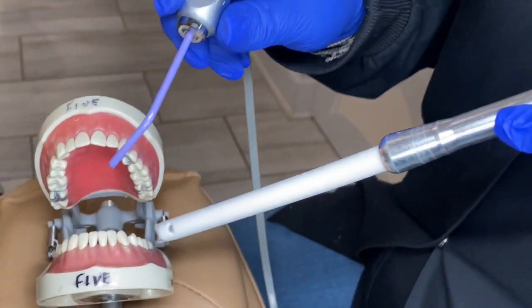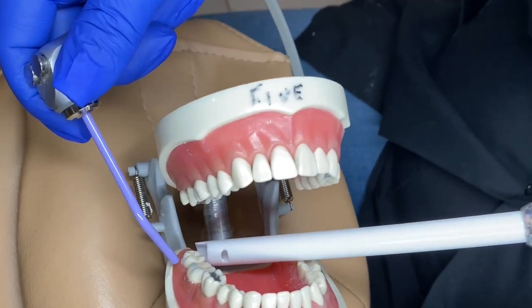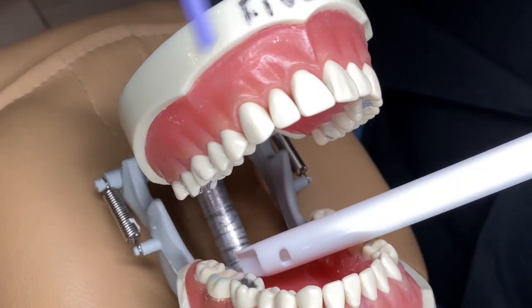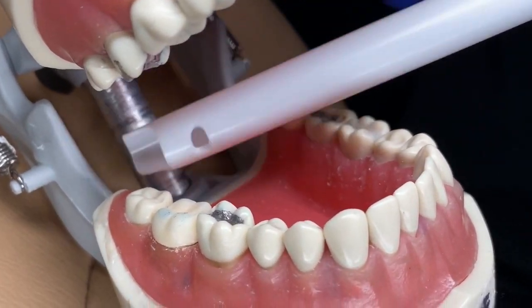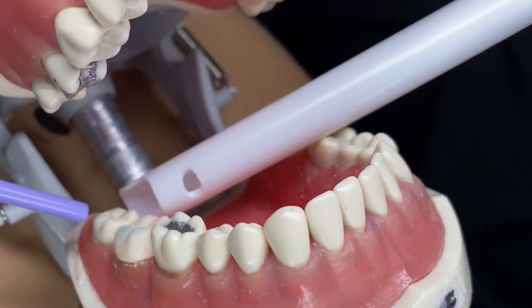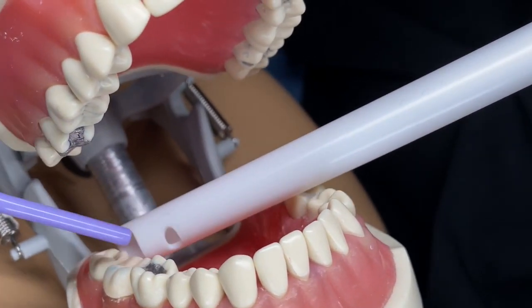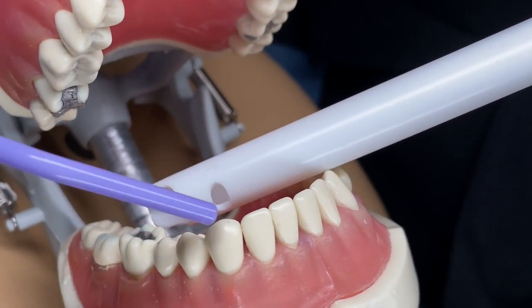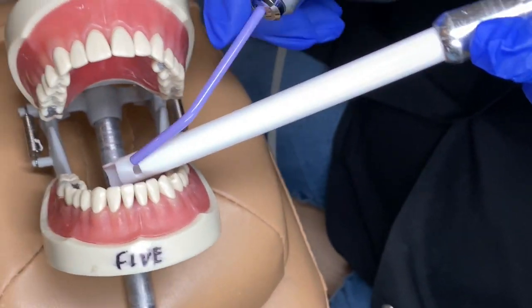If they are on the lower side — the buccal or occlusal, distal or mesial of tooth 32 — we would just follow on the lingual. Remember, whichever side the doctor is on, we're just going to be on that opposite side to catch the flow of the water. As they come along, we'll just follow where they are until we get to the premolars. Once they get to the anterior teeth, we'll never just be in their way.